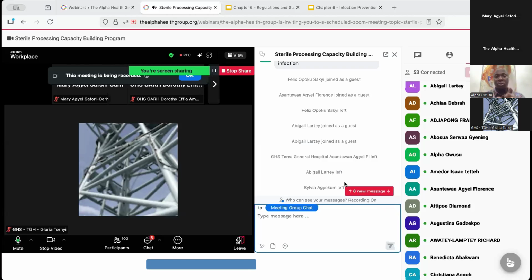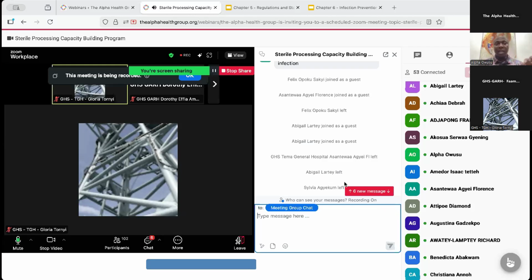When any reusable instrument or medical device is used on a patient, whether it's used on the patient or opened at the point of use by the end user, when the barrier of sterility is broken, that is when it is opened, whether it's used on the patient or not, it is considered contaminated. Hence, you have to treat it with universal precaution. Universal precaution here means when you are handling those instruments or medical devices, you have to be in full PPE.